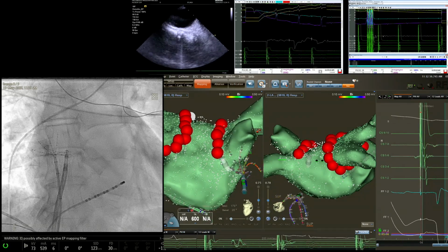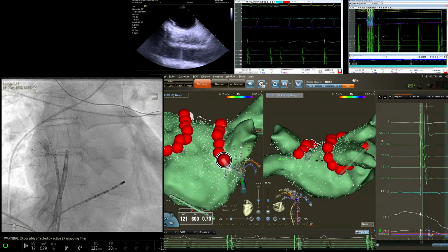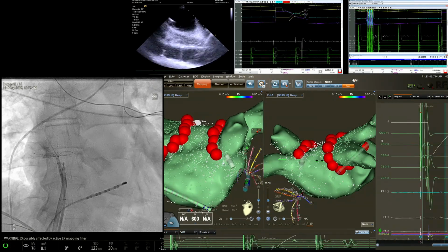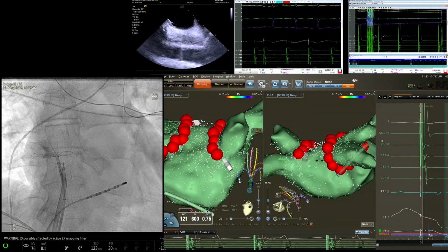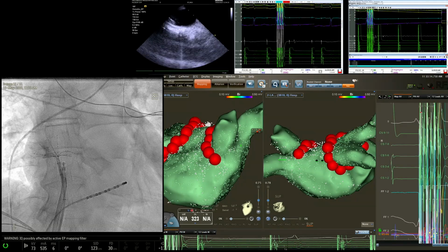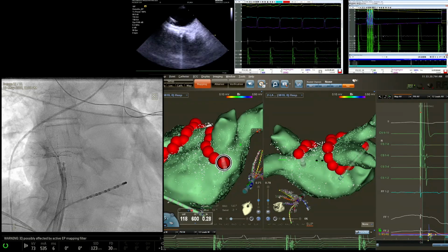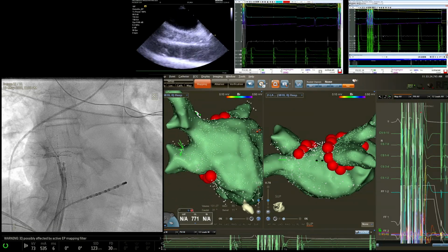Okay, let's go here. Take a point, hold on. Okay, point, hide, ablation. Okay, let's go, hold on. Okay, yeah, I like that. Point, hide, ablation. Point there. Oh, no, hold on, wait. Yeah, I like that. Hide, ablation. Go RAO, please. Yeah, thanks.